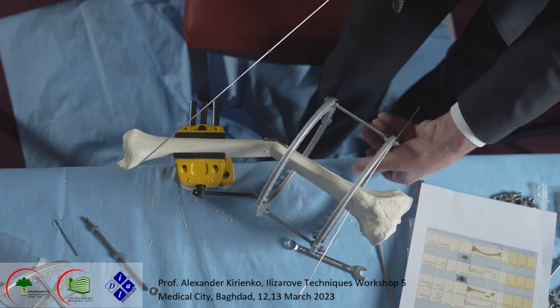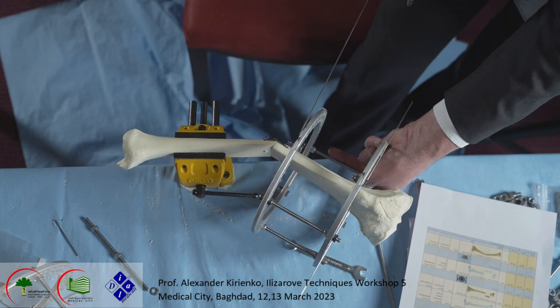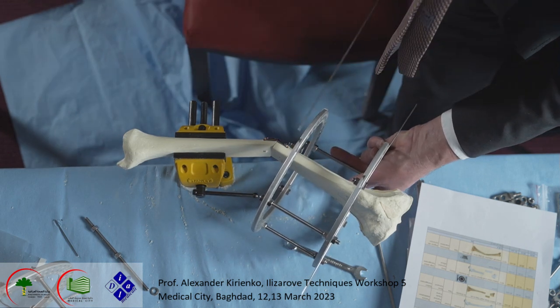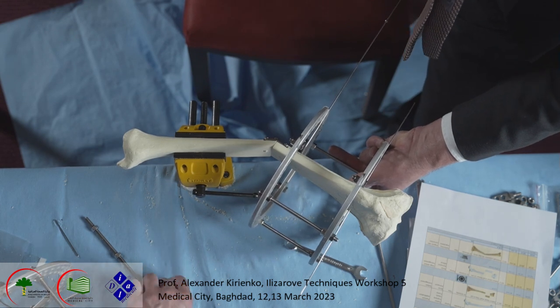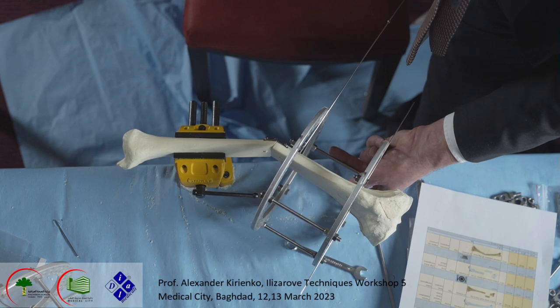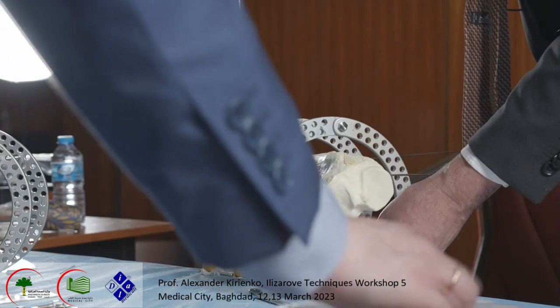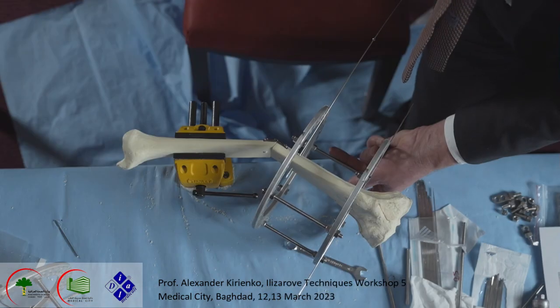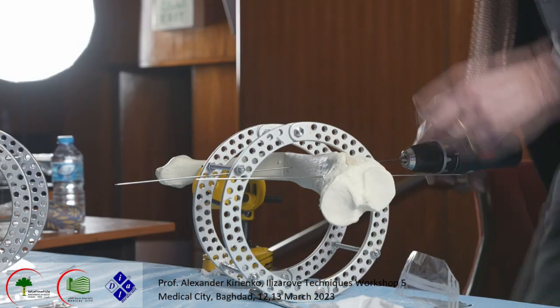And here we put the olive wire. Okay, look into the bone. If you want to do fluoroscopic control you can, but usually it's easy and understandable without fluoroscopy. Put the olive here.